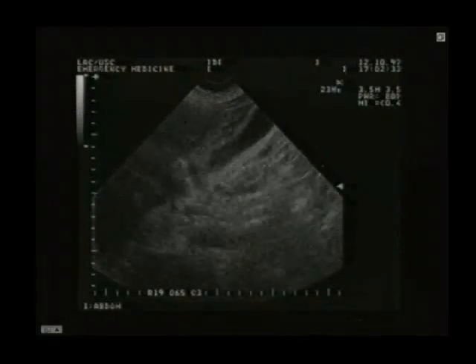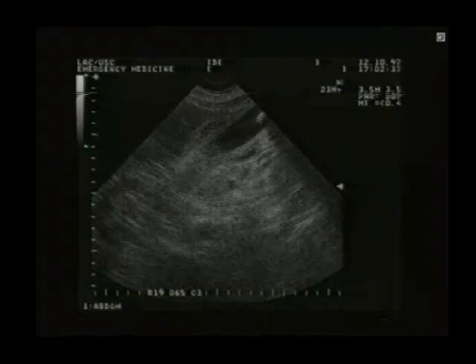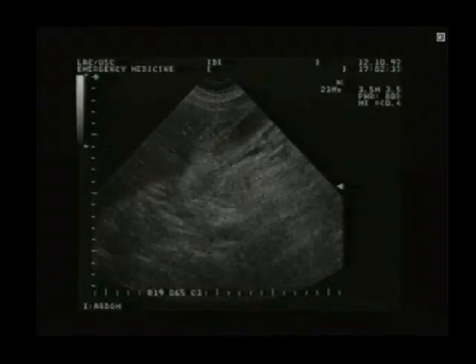Okay, so that's another sign of cholecystitis. Remember, we have the white count and a fever, the temperature. Those things aren't going to be sensitive or specific enough. So gallbladder ultrasound can provide a lot more information. It's a lot more specific.